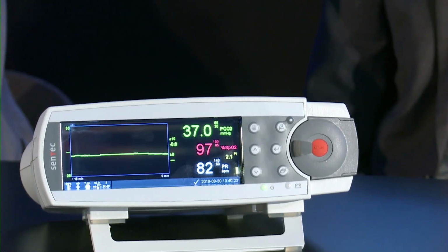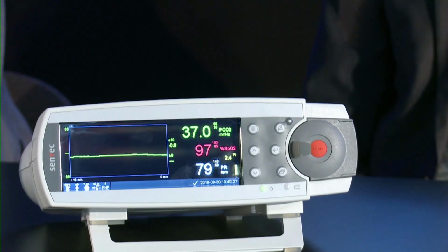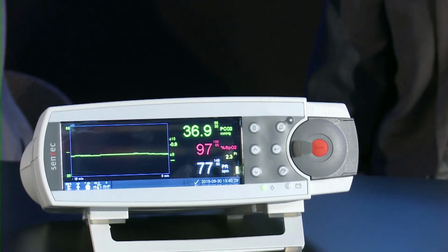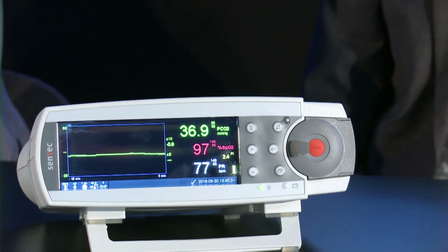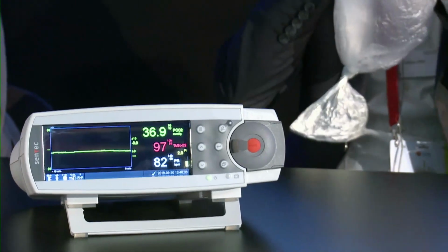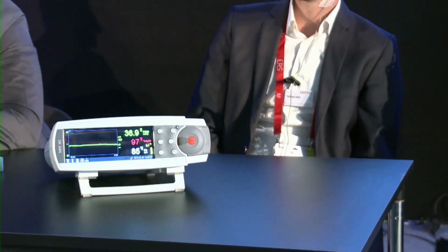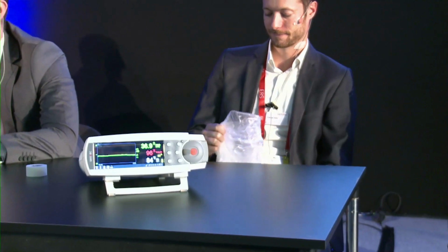measurement. And in order to show you how the measurement works and how fast the system reacts, I would like to ask Fabian to start rebreathing CO2 in the back. Before that, Fabian, just wait a second. Before he starts, I would like to count the time to see how fast it really is. Okay, you can start.